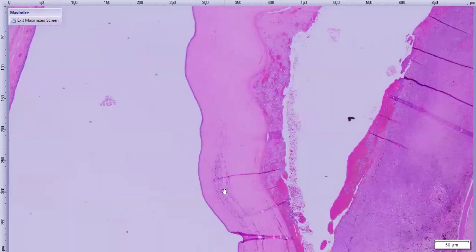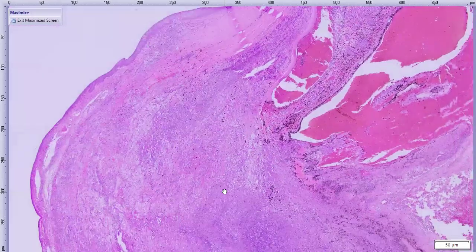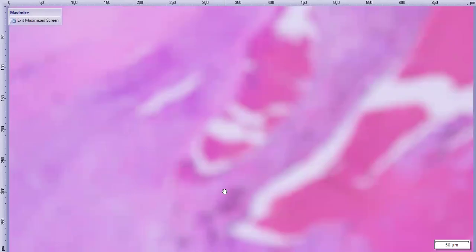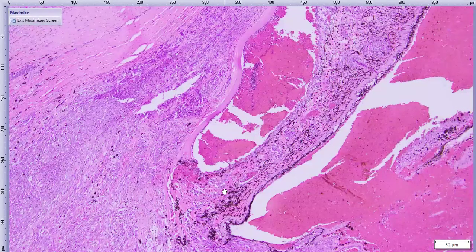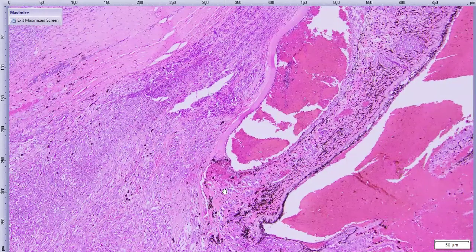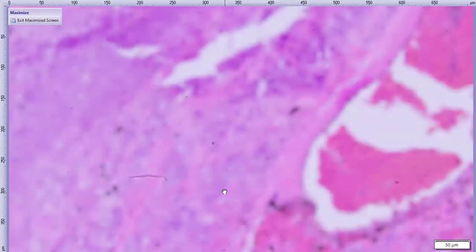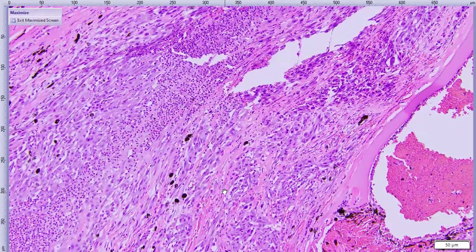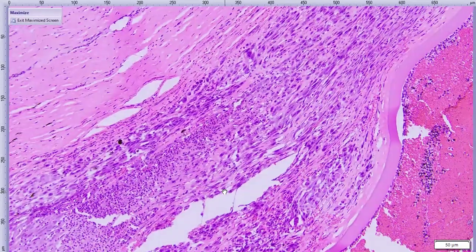But the cornea is the least of this dog's problems. So let's go ahead and look in this area. Whenever we have increased purple in tissues, that means there are too many cells, or more cells than one would expect. Like an organ like the spleen is purple because it's chock full of lymphocytes and other white blood cells. But certain other tissues should not be quite so pink or purple rather. And this is an example of a tissue that's purple that shouldn't be.